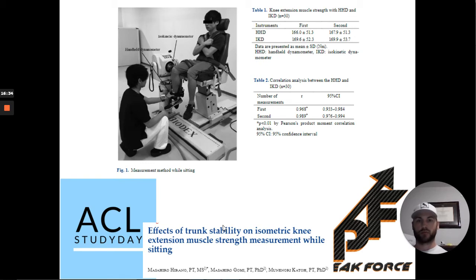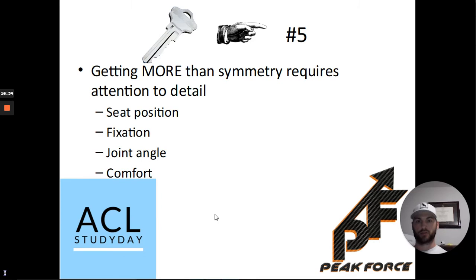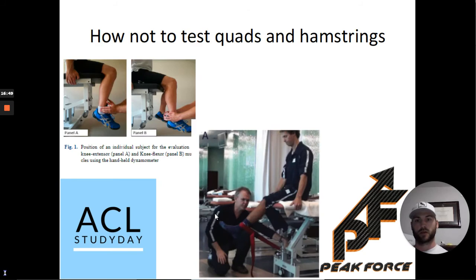So again, if you're careful about the way that you set these things up, then you can get even more information than just symmetry. So key point number 5 is that if you're interested in more than symmetry, then you need to really pay attention to detail. You've got to pay attention to the seat position, the type of fixation, the joint angle, and making sure that your test is comfortable for your subject.